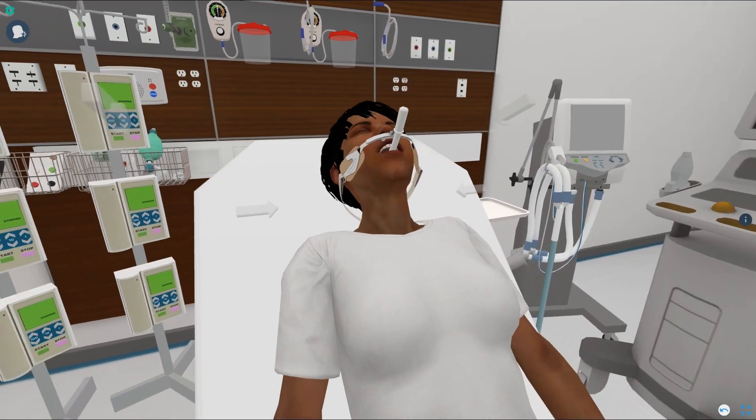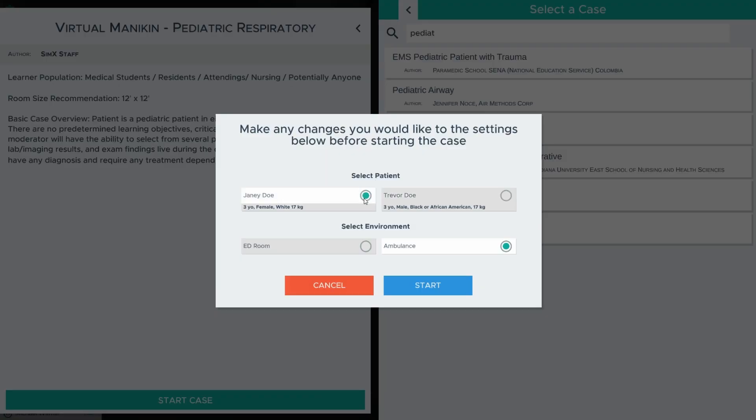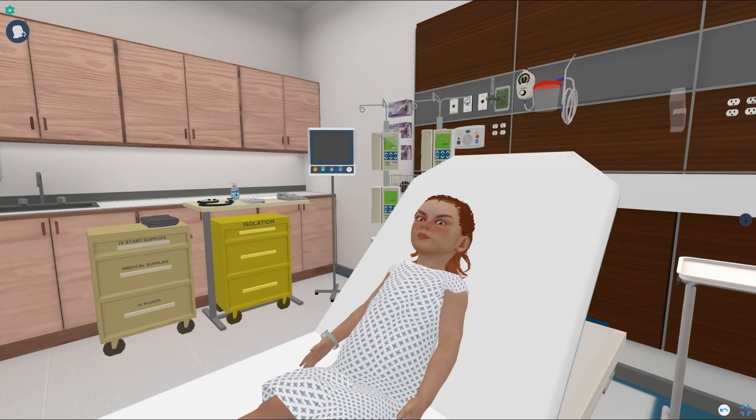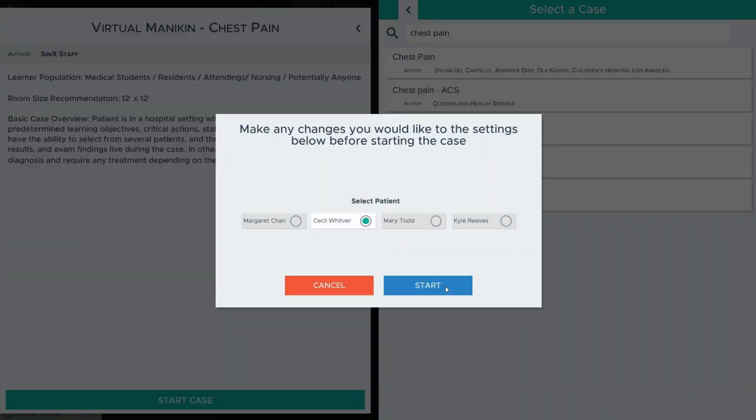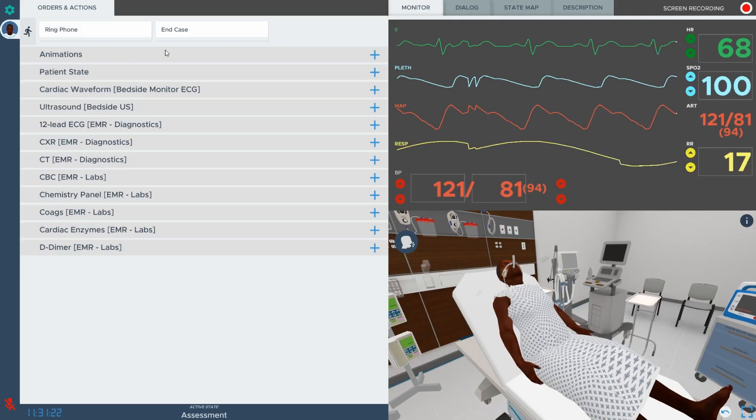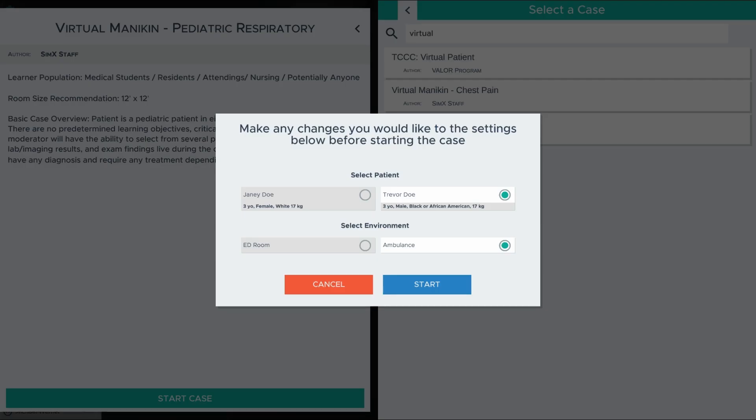To start, select the patient you would like to simulate with. You will be able to choose from a variety of demographic options, including age, ethnicity, and gender. Then, make a selection from available environments.